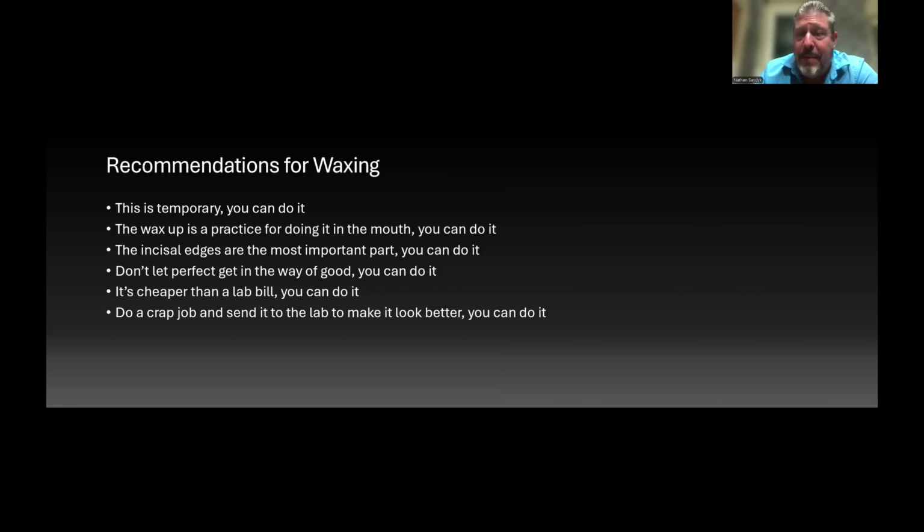Do a really crappy job of it to get it the way you want and send it to the lab and just negotiate a price for them just to clean it up a little, right? And make it a little prettier if that's what you want. And maybe make your stents. You're going to have to babysit them the first couple times though. Train an assistant to do it. You have assistants. They love doing this stuff. Empower your assistants. You're going to have somebody who's really good at this stuff. They're crafty, right? Have them do arts and crafts for your patient.